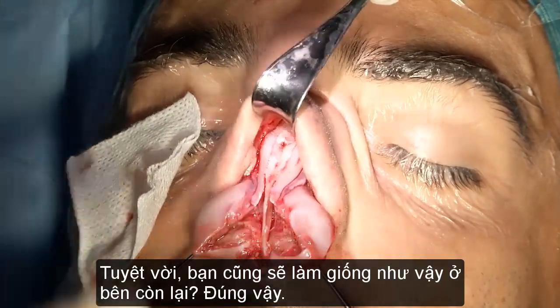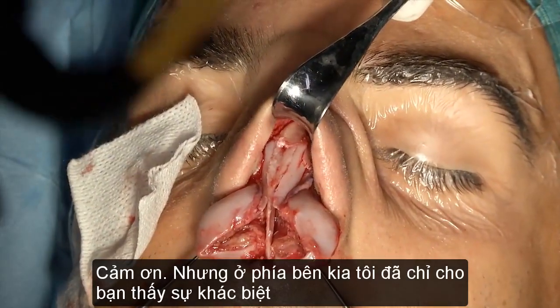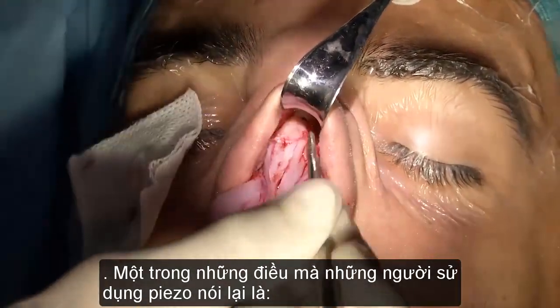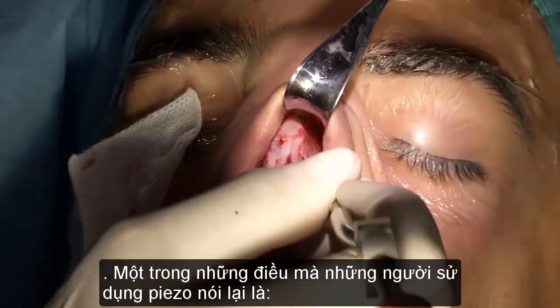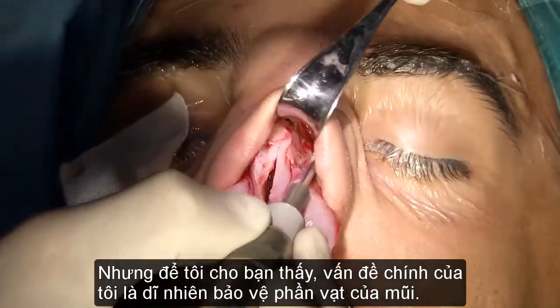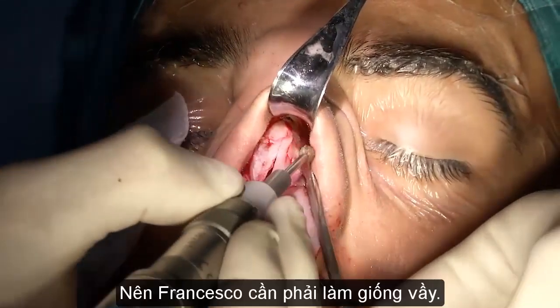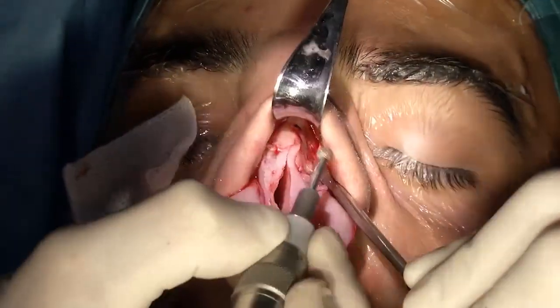But on the other side, I'll show you with a different instrument. Do you have the burr, the round one? So one of the main things that piezo users say is that with piezo you will not injure the cartilage. But if I do show you this, my main problem is safeguarding the flap, of course. So Francesco has to do this.